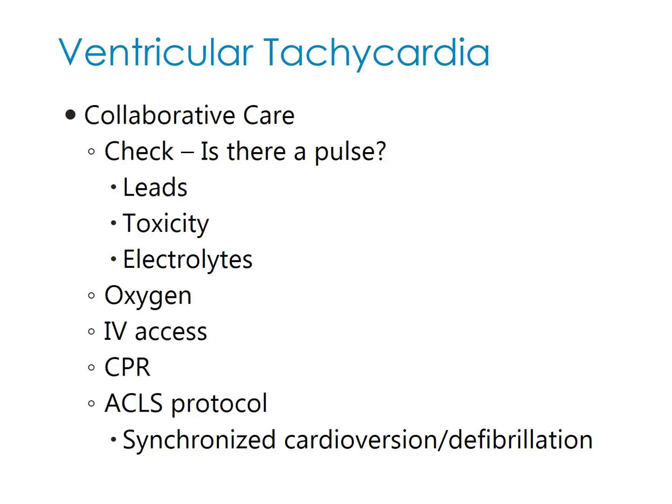So look at your client. Don't just look at that monitor and go, oh my God, my client's in VTAC. Go look at them. It could be something to where something's not hooked up correctly. So you always want to look at the client, and the first thing you want to do is check their ABCs and make sure your client is okay. Check your leads, make sure the leads are on correctly.